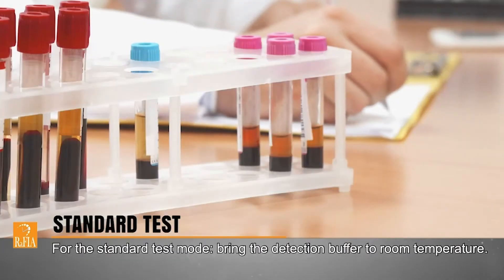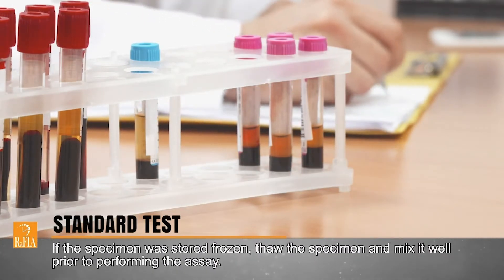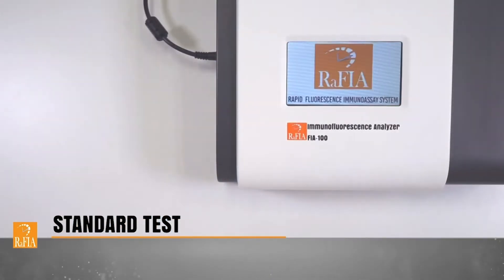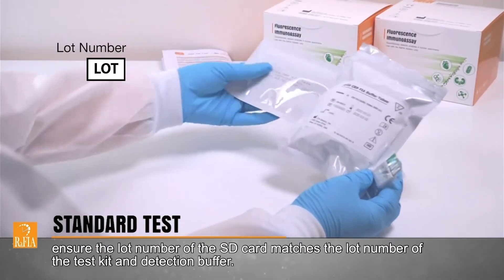For the standard test mode, bring the detection buffer to room temperature. If the specimen was stored frozen, thaw the specimen and mix it well prior to performing the assay. Turn on the analyzer. Ensure the lot number of the SD card matches the lot number of the test kit and detection buffer.